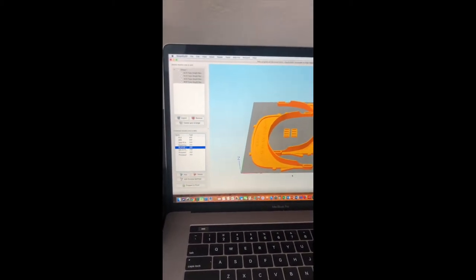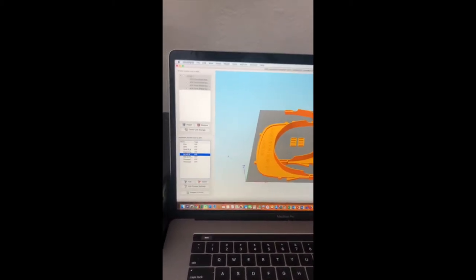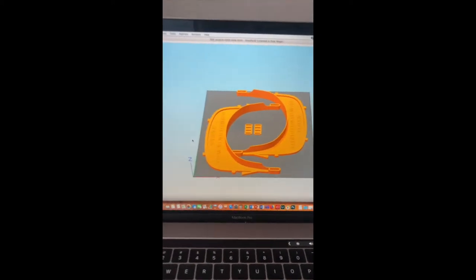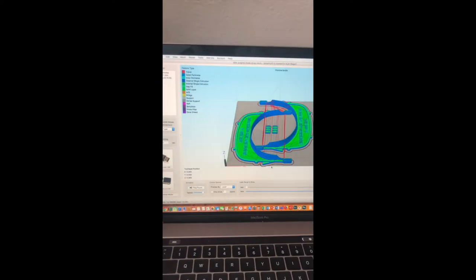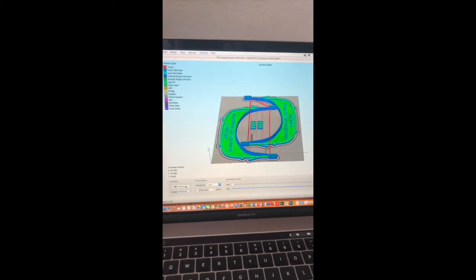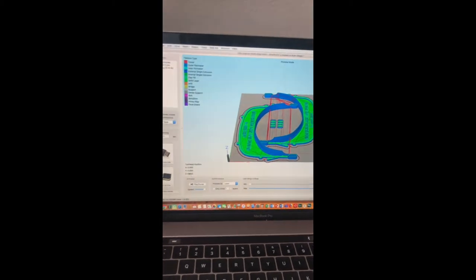Without going into those complicated details, you can essentially think of it like I'm applying the recipe that I have here on the left to the 3D geometry that I have here on the right. So when I go to prepare the print, it's going to give me essentially a preview showing how the model is printed, and I can analyze that preview to identify any potential issues. And if it's ready to go, I can go ahead and save that file.